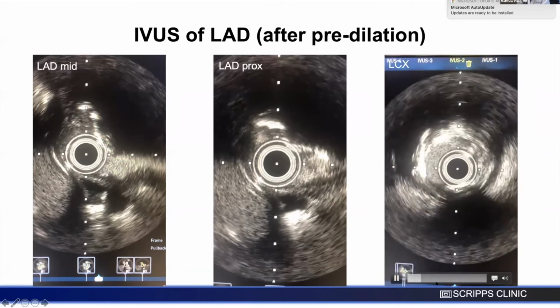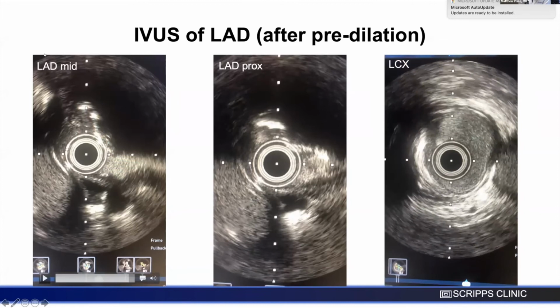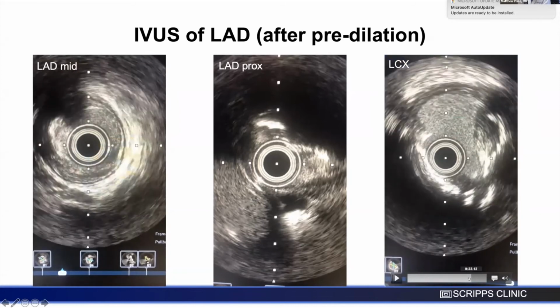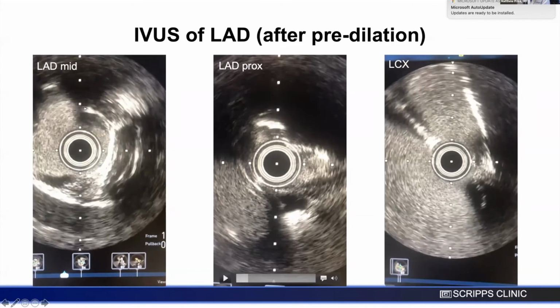I'm not sure. There's that lesion in the circumflex. You see very nicely there. Okay. I wanted to show the ostium of the circumflex. Sorry, here. Once again, that's again the ostium of the circumflex. I think no problem with doing a provisional stent from left main to circ.